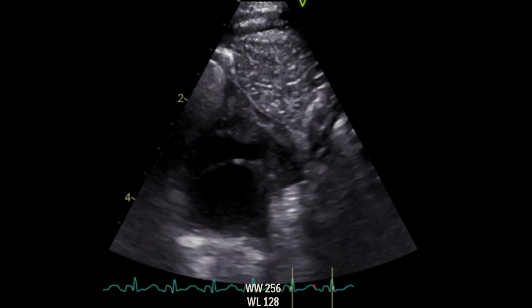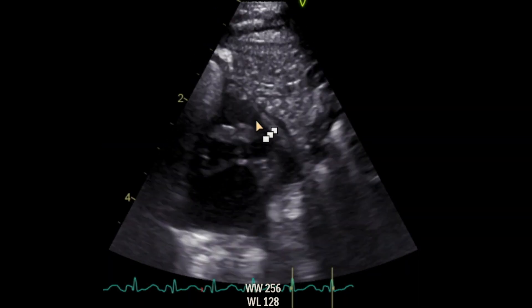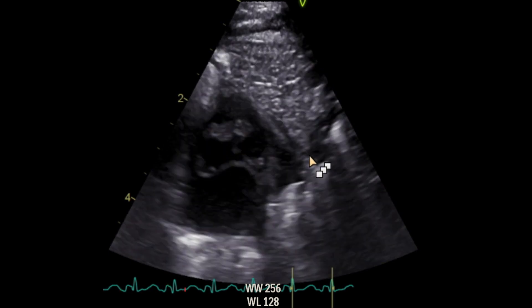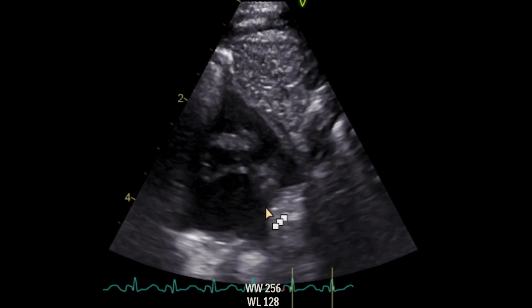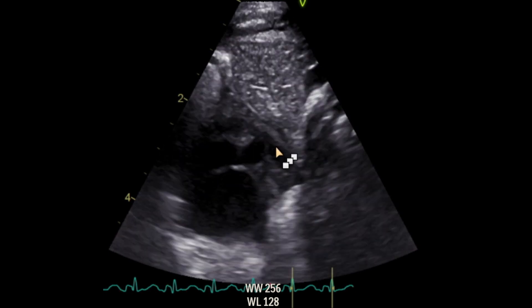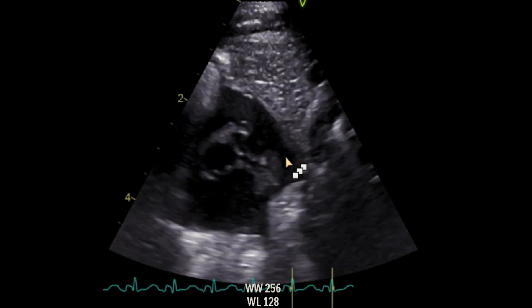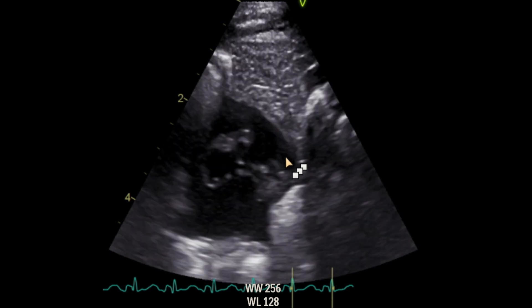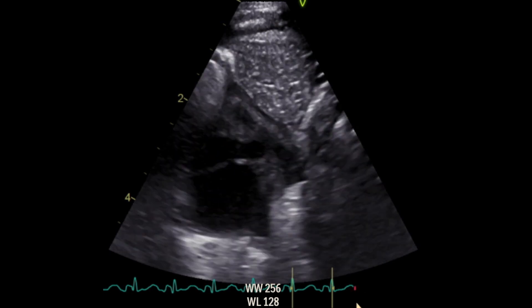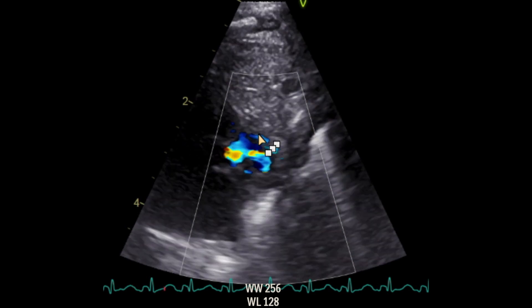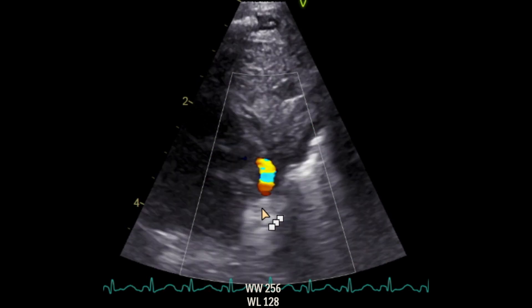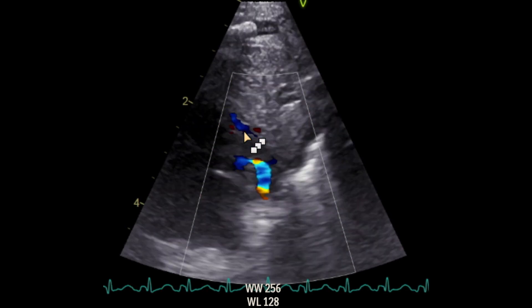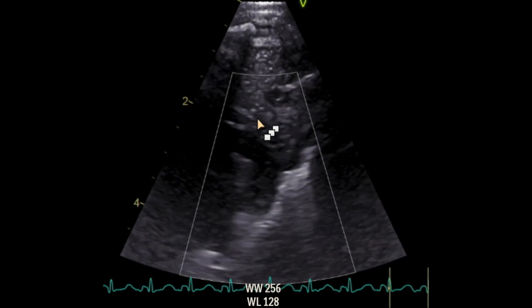This is a 2D view to show you the PDA. This is the main pulmonary artery, and the descending aorta should be coming from here, and this area here is the PDA. It's a pretty big PDA, actually. Now, if we put the color on, you can see it — descending aorta and the PDA.